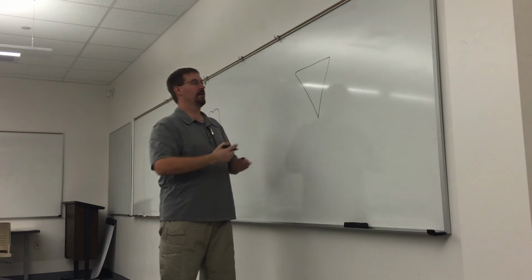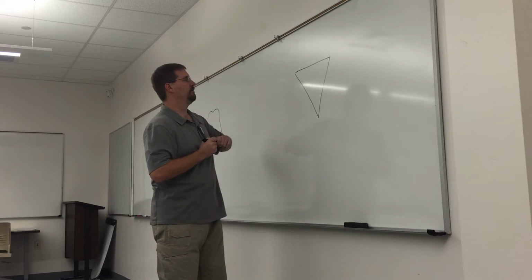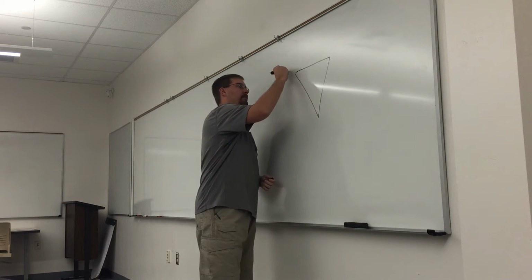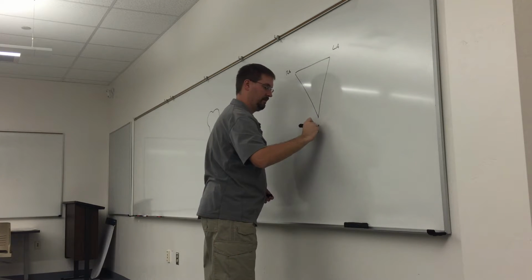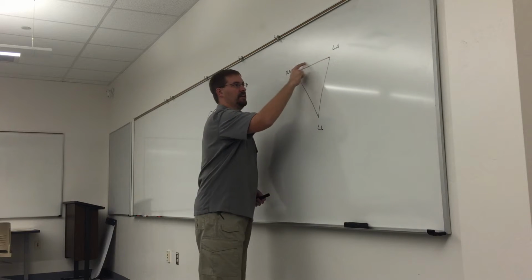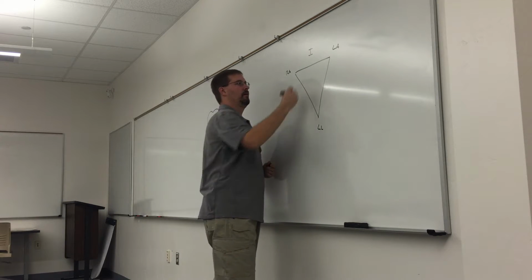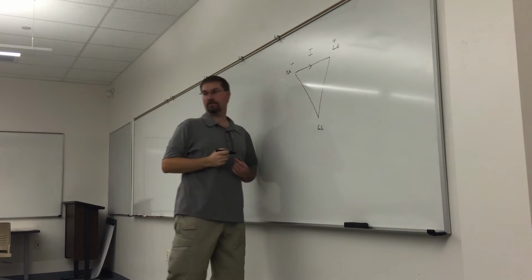Okay, what does it represent? The leads and directions to go. Okay, so what electrode is this here? Oh, right arm. Okay, this is the right arm. All right, this is the left arm, and then the LL. Okay, cool. So what lead is represented here? One. Okay, this is lead 1, and what direction? To the left, LA. Okay, so the LA is the positive, and RA is negative. You guys cool with that?